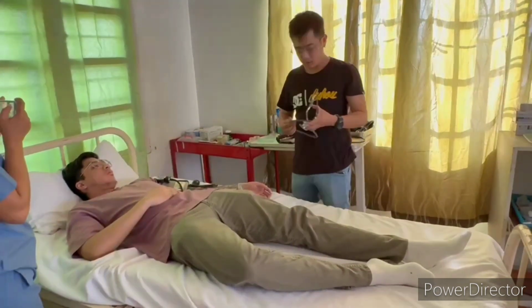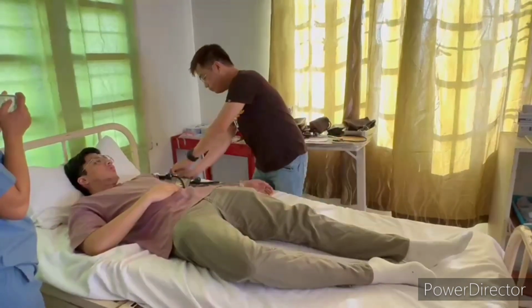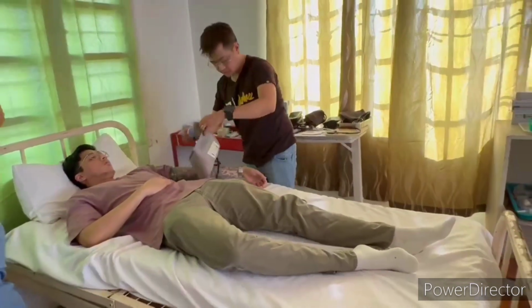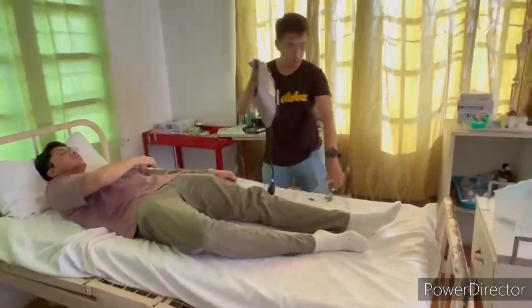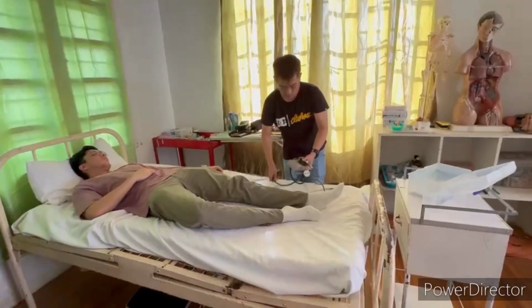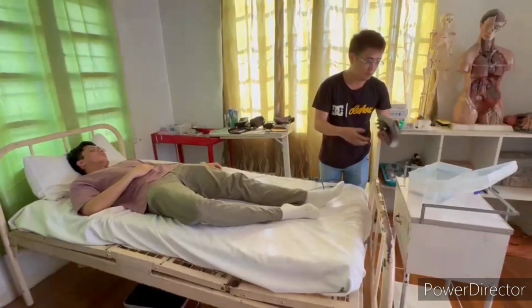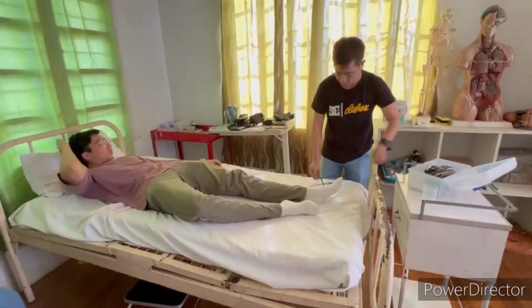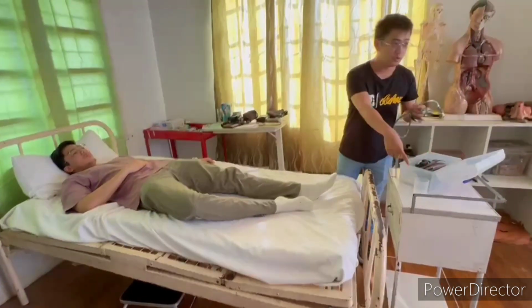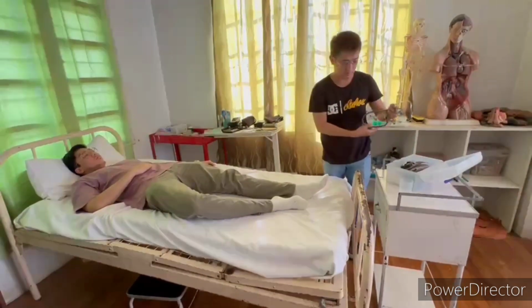So after getting the blood pressure, remove the sphygmomanometer from the patient, and then before putting back the BP apparatus in the box, we have to clean the stethoscope again using the cotton ball soaked in alcohol. Okay?